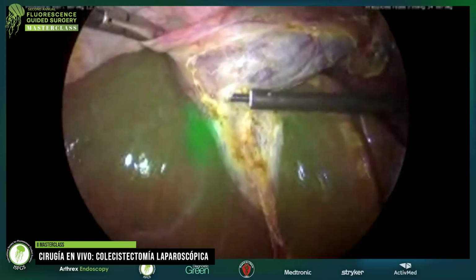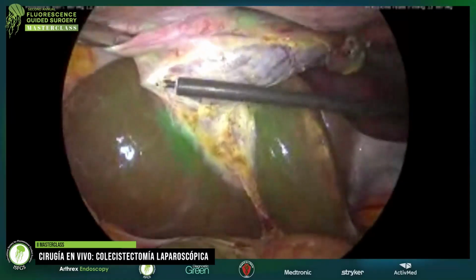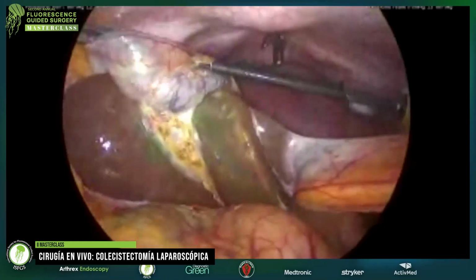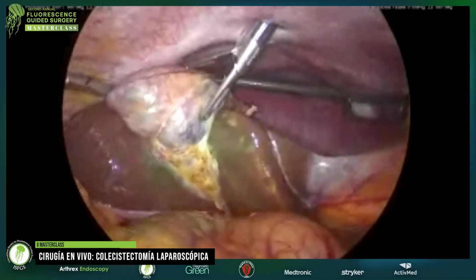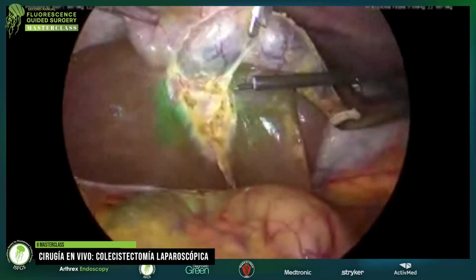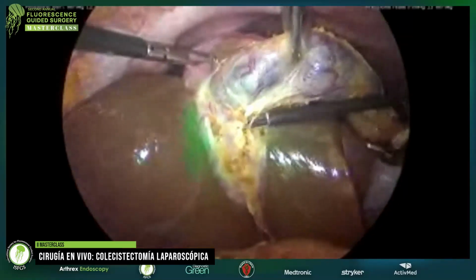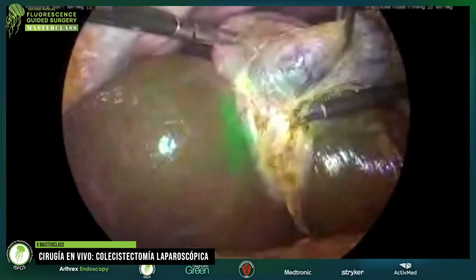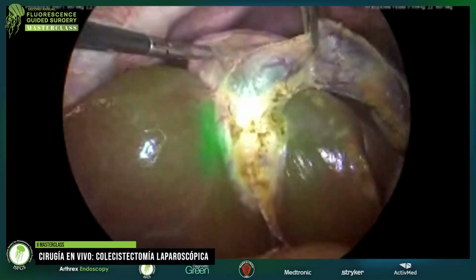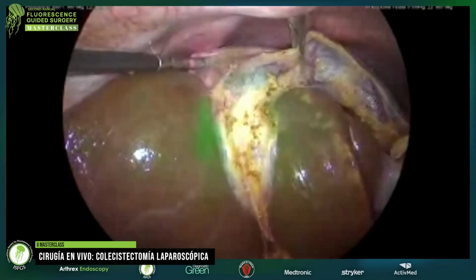Yes, what I was saying is that for bowel perfusion and for lymph node dissection during gastric cancer, it is quite widespread. For gallbladder, actually, I have to say, and I'm a bit disappointed about that, because Ludovica just explained very well the reason for this disappointment: the usage is quite limited. People always think, oh, if I have a simple gallbladder, I don't really need it. But Ludovica explained very well that unfortunately common bile duct lesions are present even during simple cholecystectomy. And on top of that, you never know when a cholecystectomy that's supposed to be simple becomes difficult.